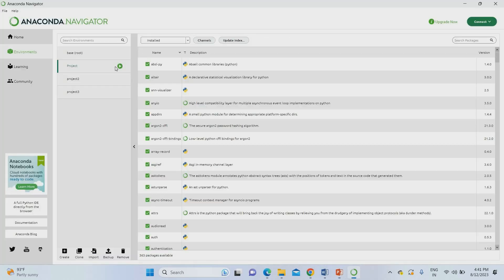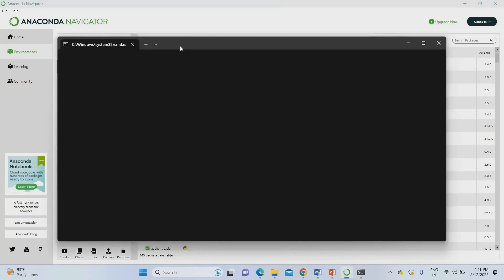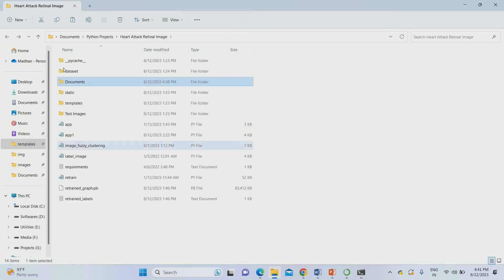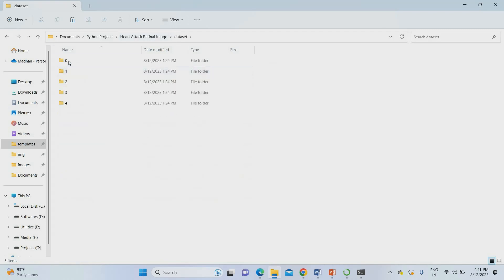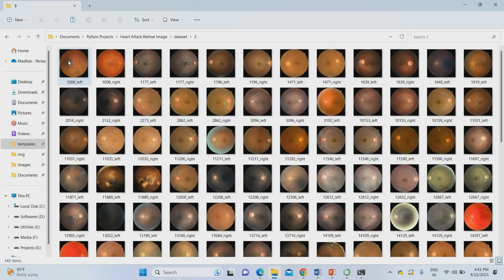To run the project, I am going to open the project terminal. Once I click it, it will open the project command prompt. I have to go to the project folder. You can see the dataset — we have collected various retinal images as a dataset.